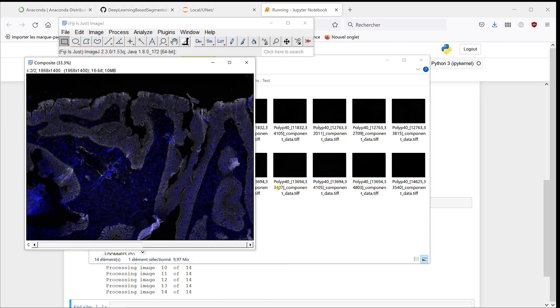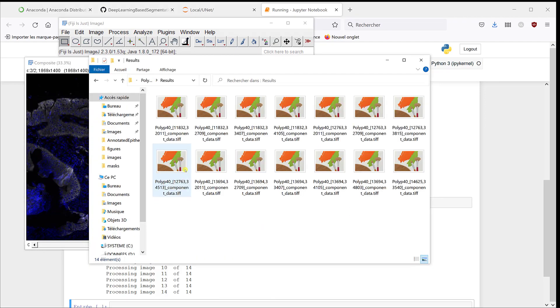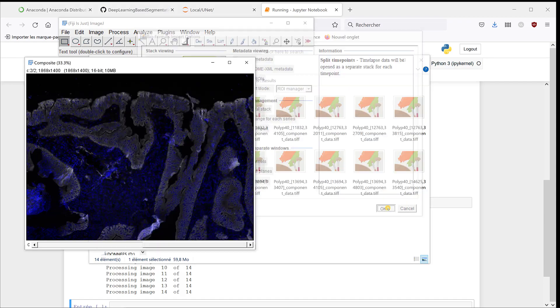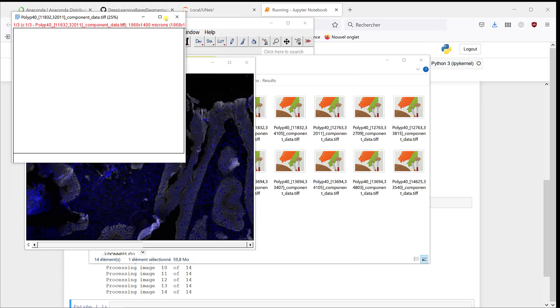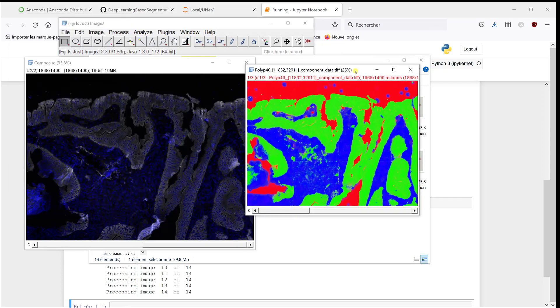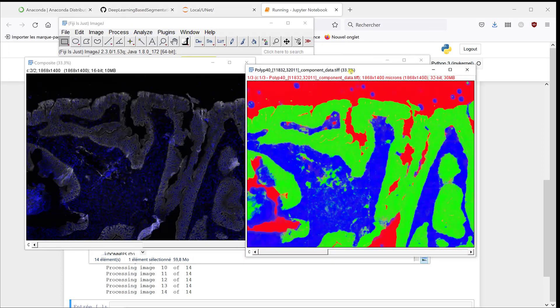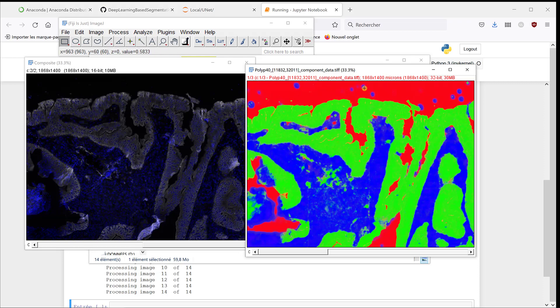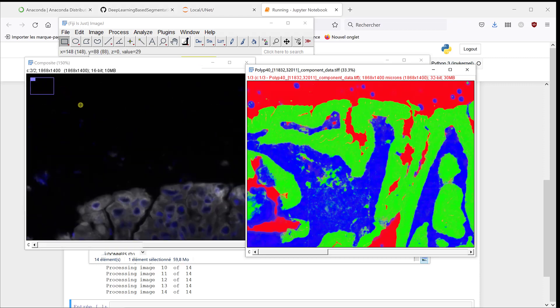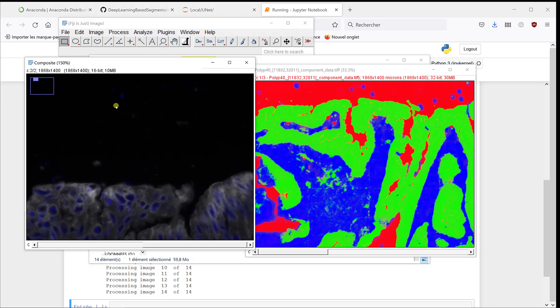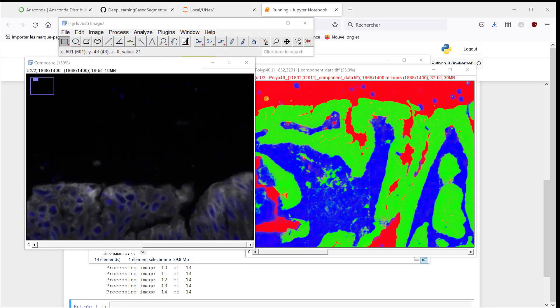And I can have a look at my results. So if I go back to the results and open it, that's what we've got. So as you can see, it looks pretty fine here. The background is in the back, the epithelium is in green, and stroma is in blue. Interestingly, we have some stroma islands, and it actually corresponds to isolated regions.